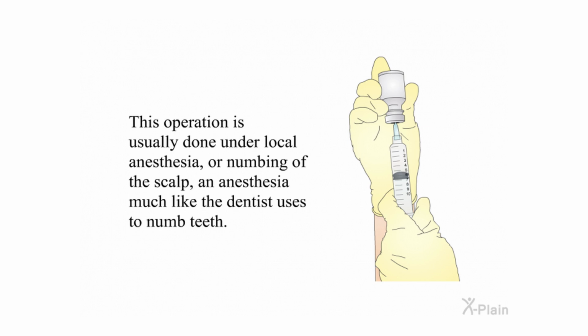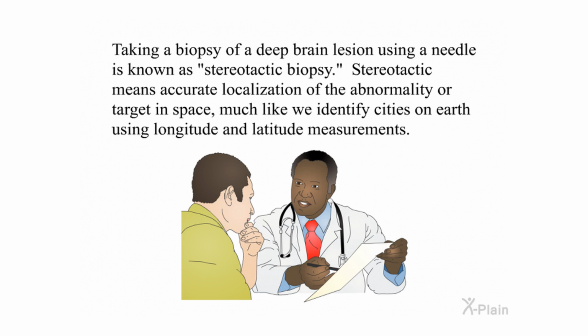Procedure. This operation is usually done under local anesthesia, or numbing of the scalp, an anesthesia much like the dentist uses to numb teeth. Taking a biopsy of a deep brain lesion using a needle is known as stereotactic biopsy.